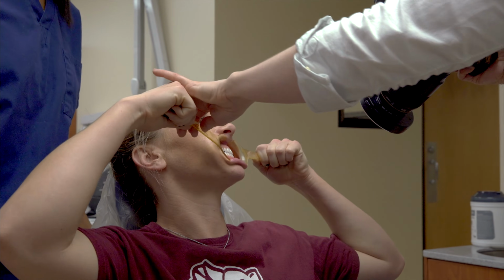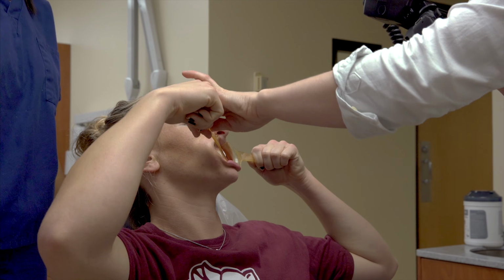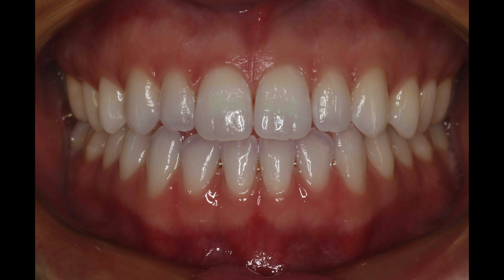Also, ask your patient to position her head to make it easier for the photographer when possible. Here's an example of the anterior facial shot. Ideally, the midline should be in the center of the photo, all teeth are in focus, the lips are not bowing significantly towards the teeth, and the occlusal plane is parallel with the top and bottom of the photograph.